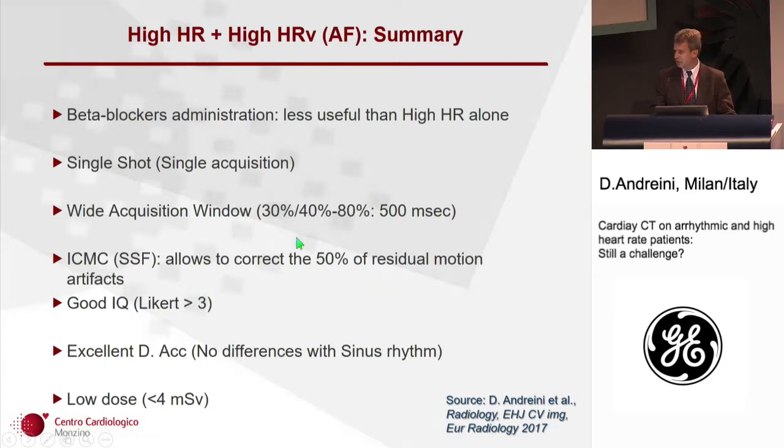Snapshot freeze is very useful in this setting, and we have an average of more than good image quality with excellent accuracy, and the dose is very good, less than 4 millisievert in all cases we did with this type of scanner.